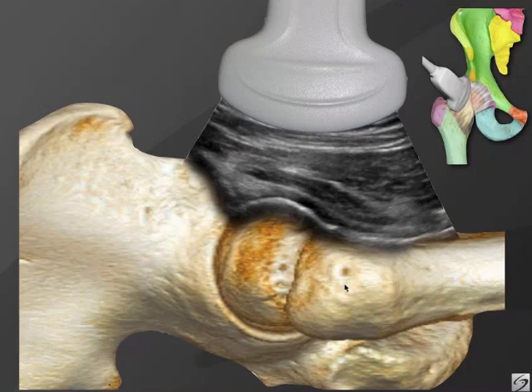There is the femoral neck here. Here is the femoral head. The bony acetabulum is here, the cartilaginous acetabulum is there. This hyperechoic line is a combination of the iliofemoral ligament and the joint capsule, and as you can see, it extends a fair distance distal down the femoral neck and folds back around. This is within the joint space and will be our target. The junction of the femoral neck and the femoral head is where we want to place our needle.